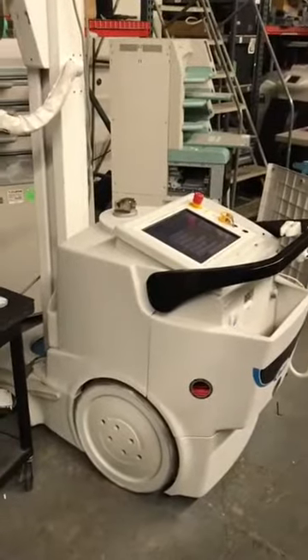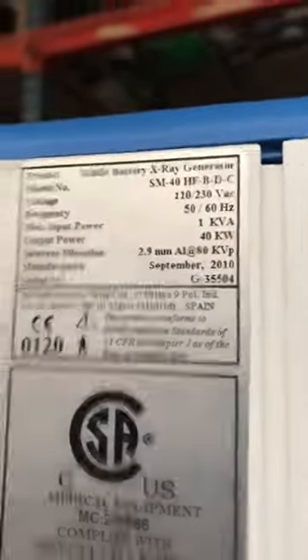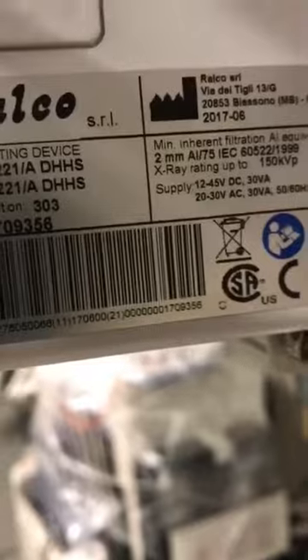This is a Rad Pro 40kW — it's a 2010 system and it comes with a CXDI 55g tethered panel. The unit itself was manufactured in 2010. The tube and the collimator are from June of 2017 — they were replaced a year ago.